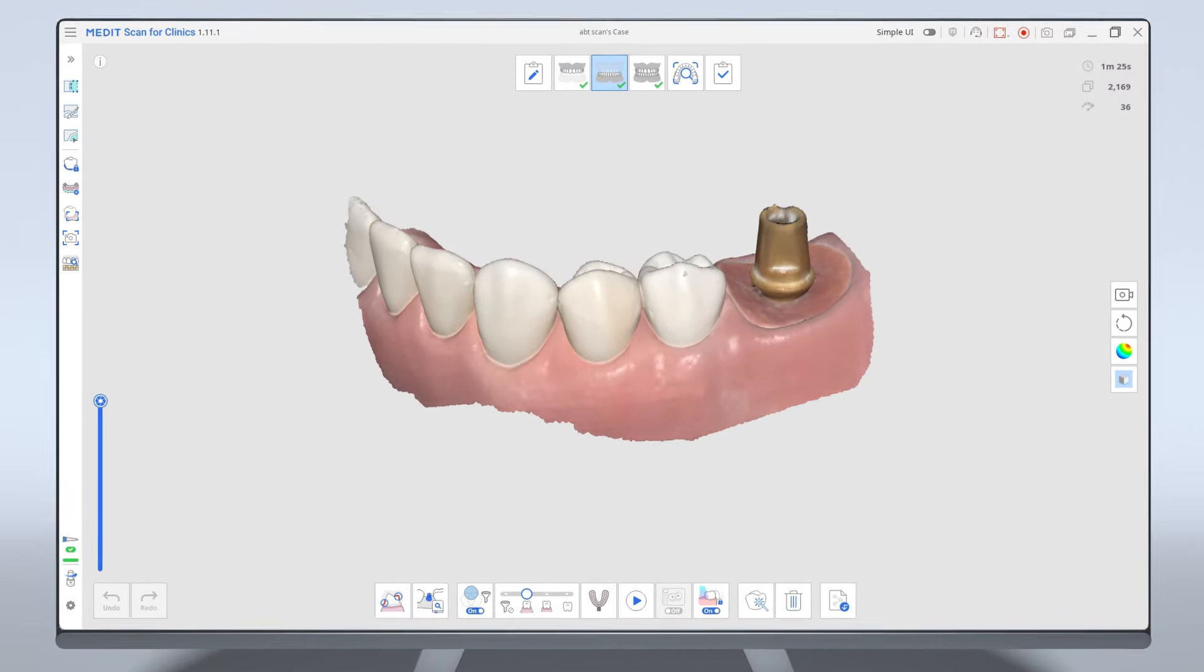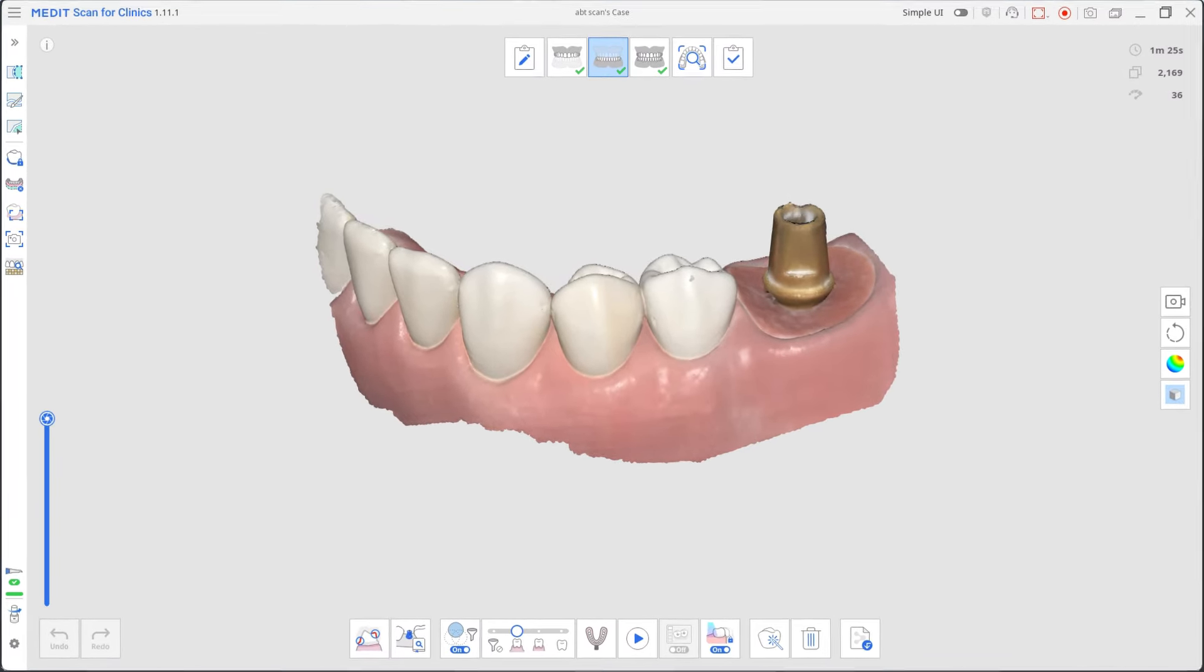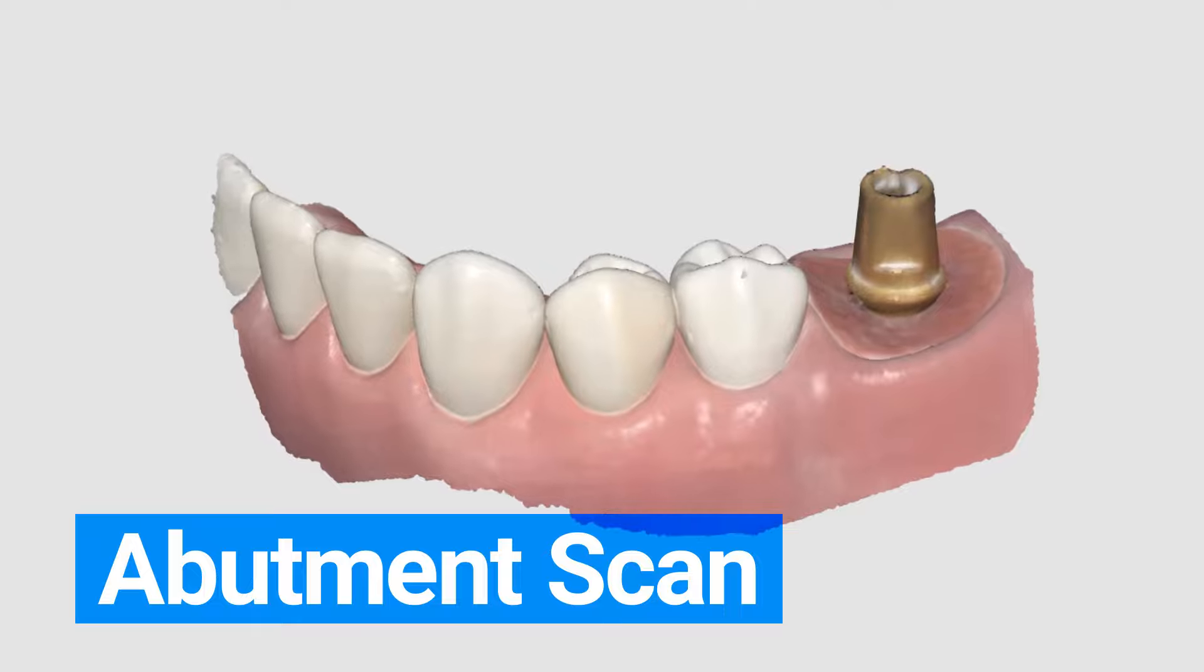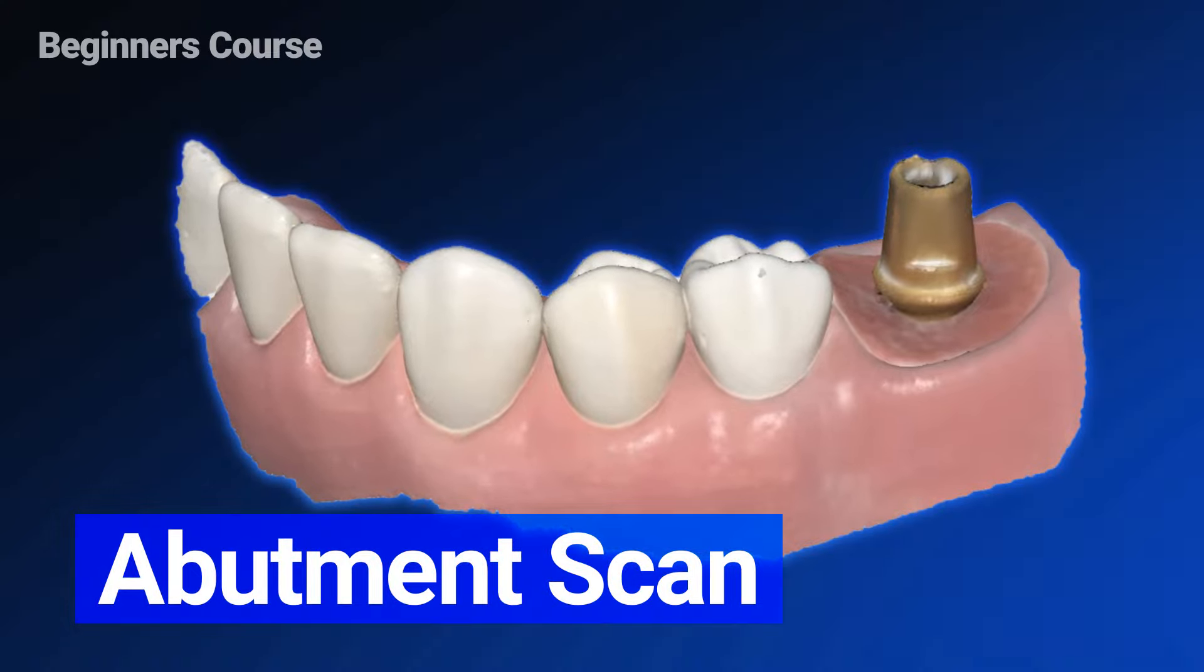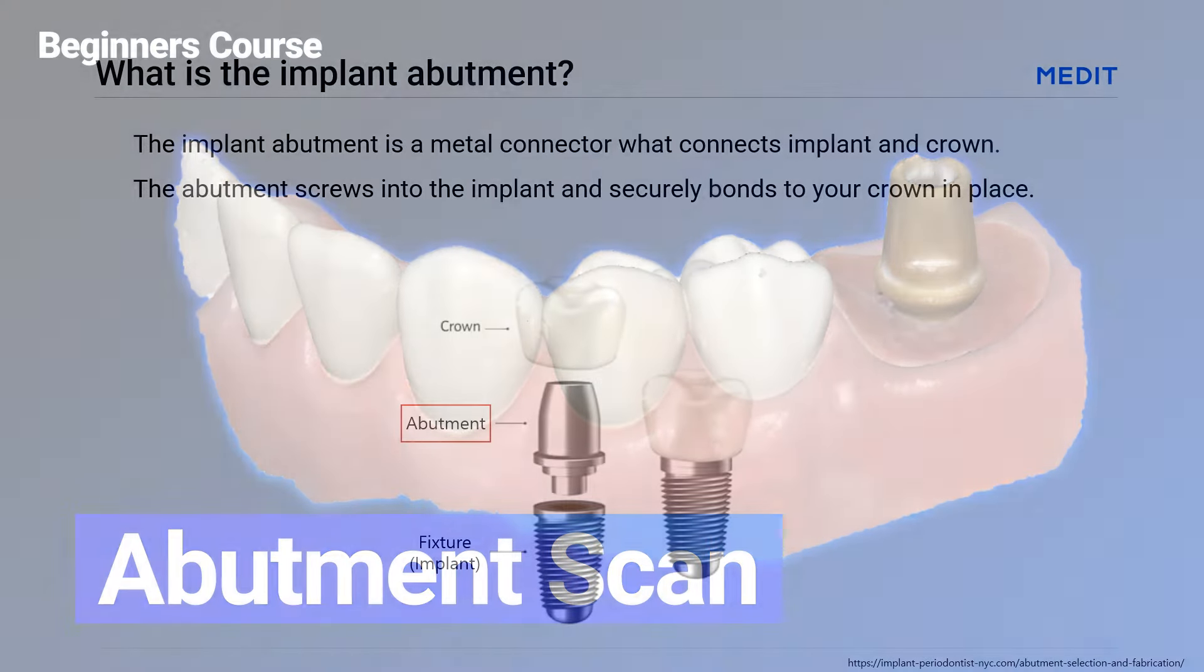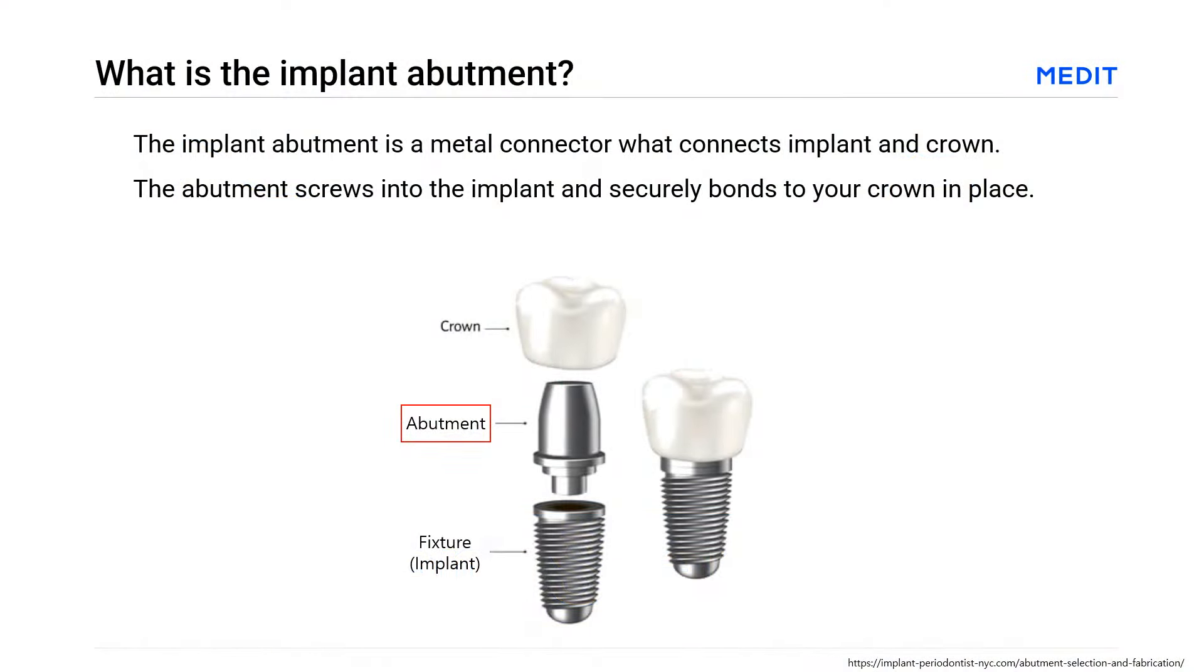This is a quick demonstration on how to scan the stock abutment and send it to your lab. First, the implant abutment is a metal connector that connects the implant and crown. The abutment screws into the implant and securely bonds to your crown in place.